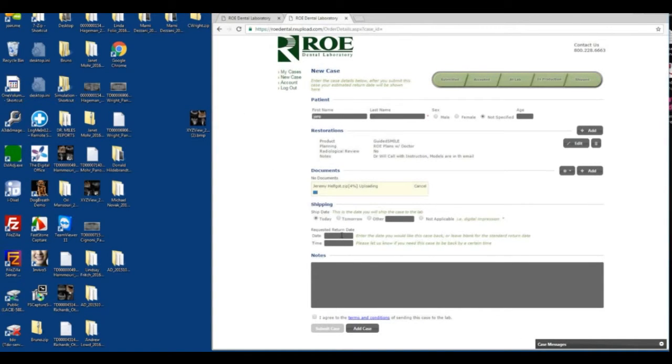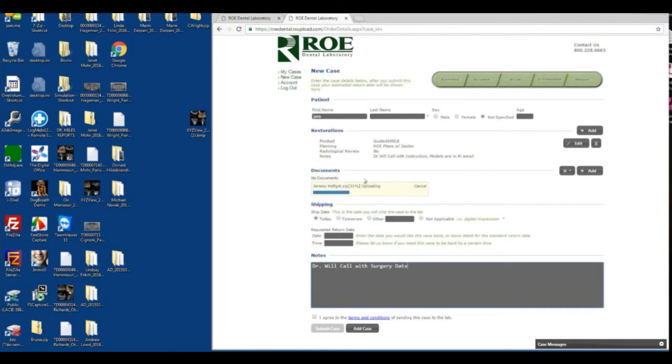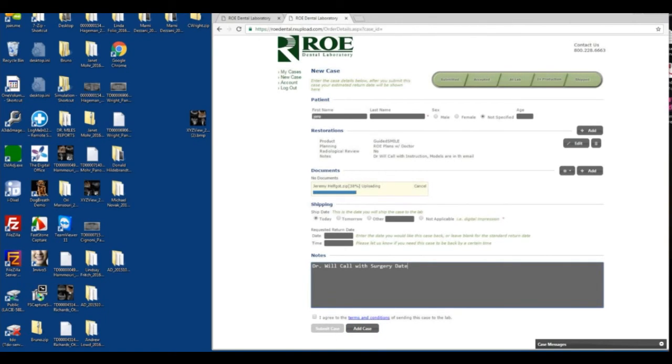Doctor will call with surgery date. Once this is at 100%, I click I agree, and then you click submit. And that's it. We have all the data in the case ready to go.